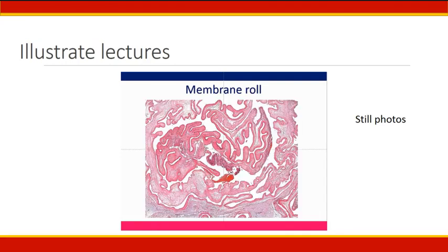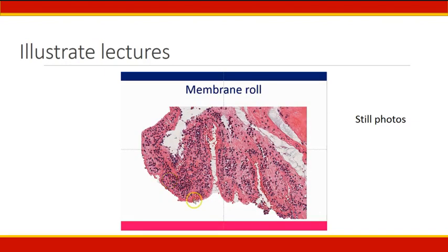So instead of searching through slide trays to find a perfect roll, and photographing at multiple objectives, including the whole slide, which you can't do on a microscope camera, I just took screen clippings from this online e-case, which is at least 10 times faster, and acknowledge the source by pasting the URL into the bottom of the slide. Now pathology registrars can click the URL in the digital handout and examine the slide themselves, thereby making the information transfer more active and participatory on the part of the registrar. You and I are allowed to copy and share and distribute these cases for educational purposes.